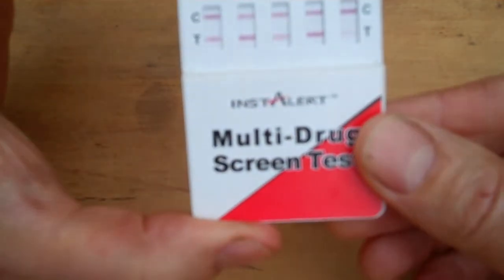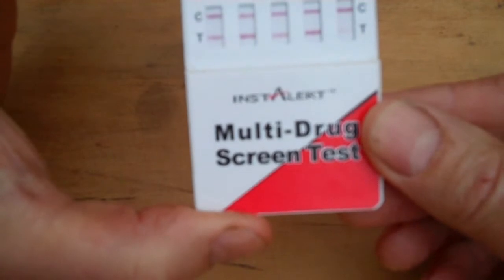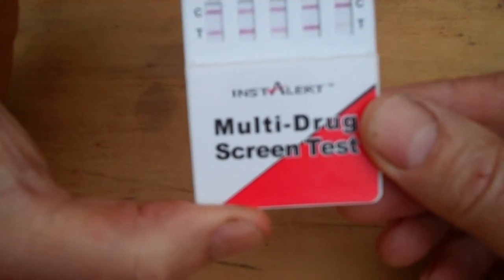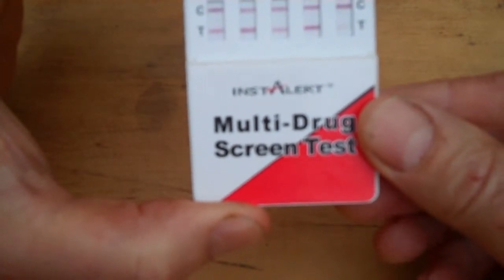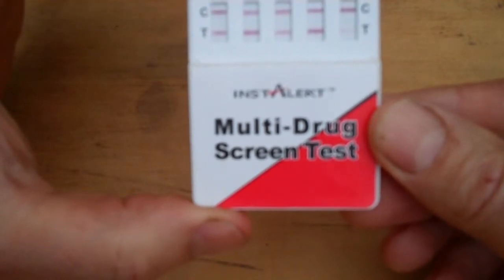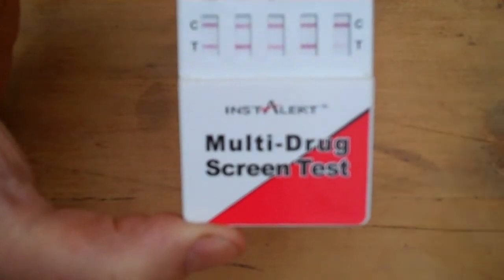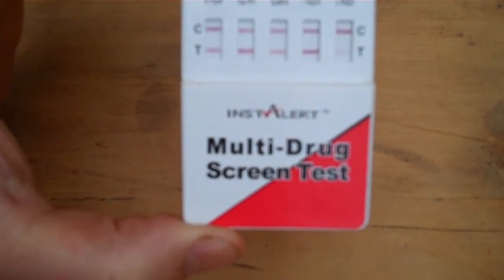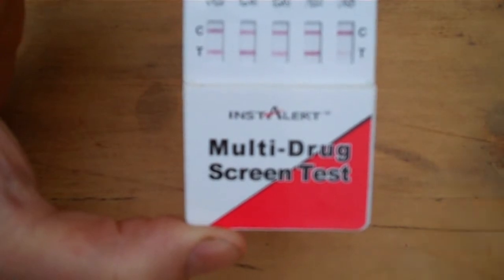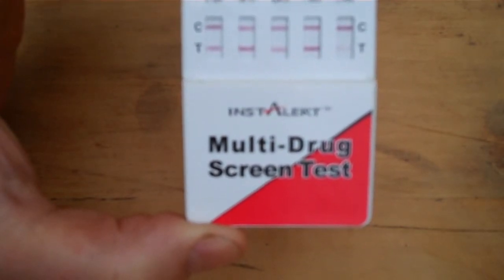The problem comes when you start getting positive results. Now, you have to interpret a positive result at the specified time that the manufacturer has given you on the full data sheet instruction that is supplied with these tests. And in the case of InstAlert, that's 8 to 10 minutes. So if you have no test line showing at the 10-minute stage, then that is a positive result. But obviously that does slow your testing procedure down somewhat, that you've got to give it that period of time.